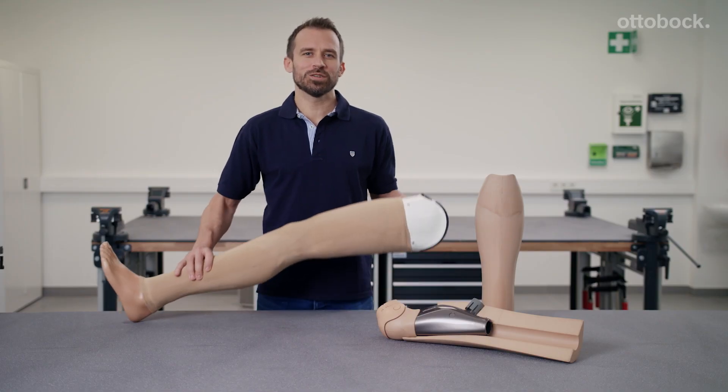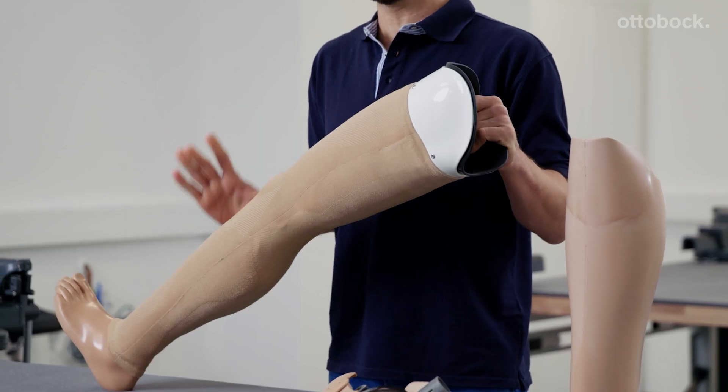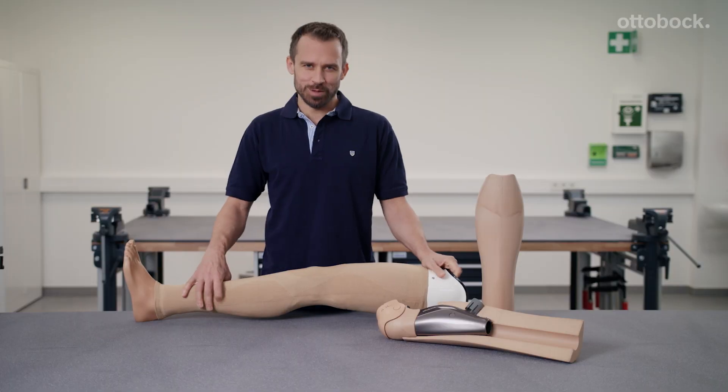Overall, the functional cosmesis replicates the natural volume of the leg in an incredibly accurate way. When my customers are satisfied, I am satisfied.